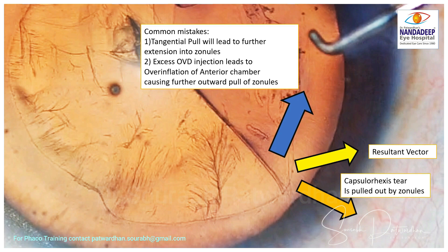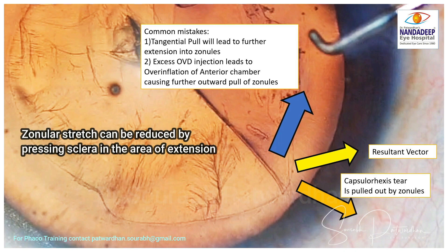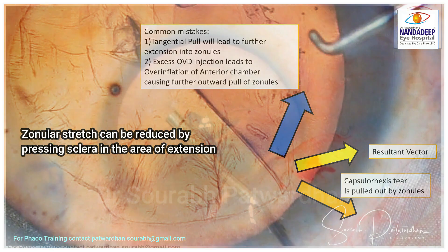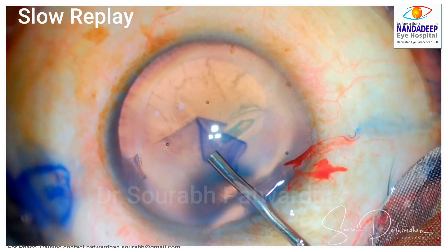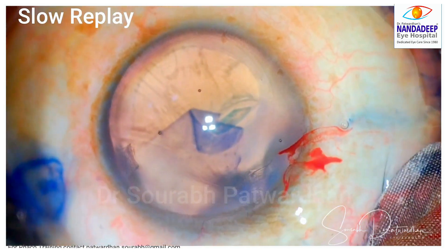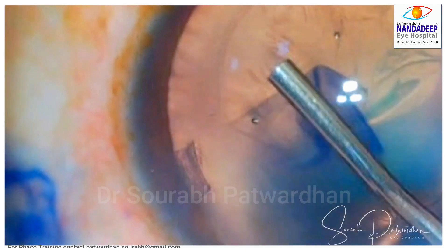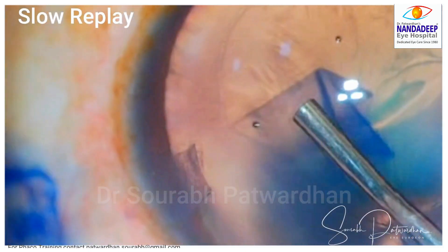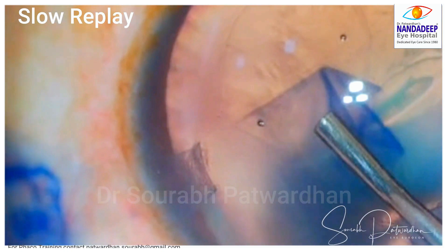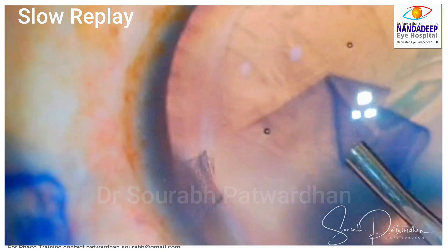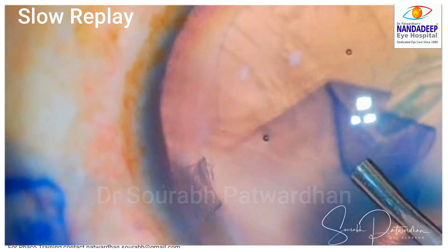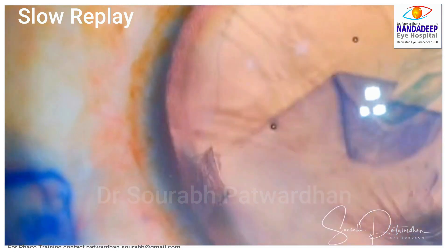The second common mistake is injecting excessive OVD, resulting in over-inflation of the anterior chamber. Watch this case where the surgeon over-inflates the anterior chamber using 2% HPMC — what you find is that the zonules start pulling the capsulorhexis tear even more outward because of the over-inflation.